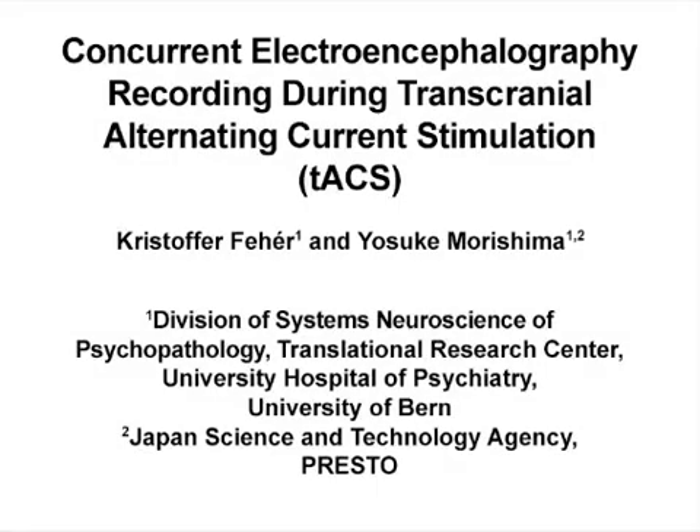The overall goal of this protocol is to demonstrate how to successfully set up concurrent transcranial alternating current stimulation and EEG with important technical considerations in order to acquire a successful recording.